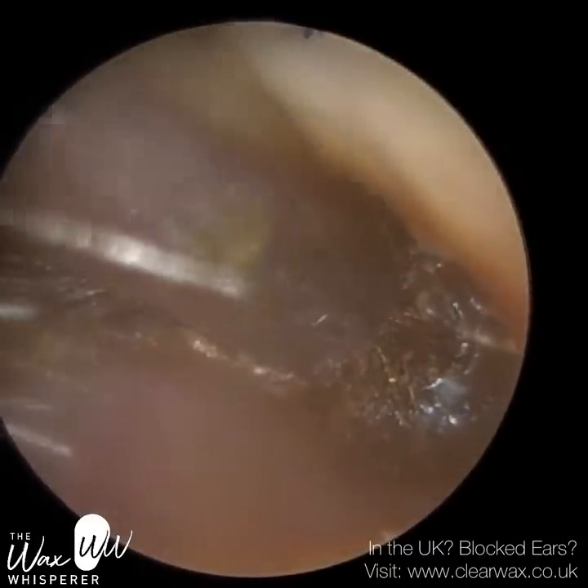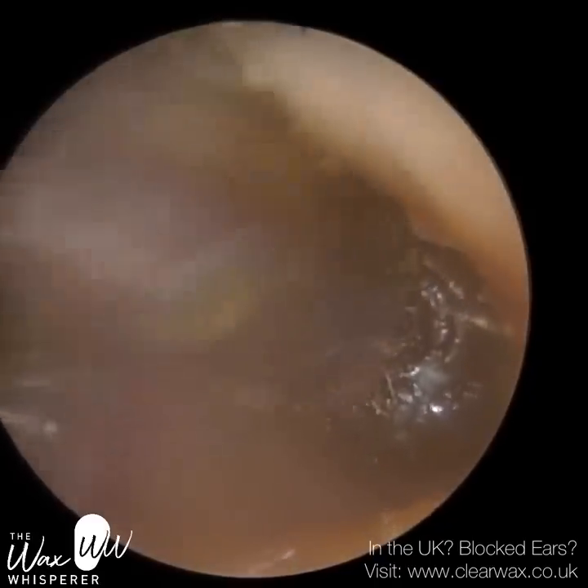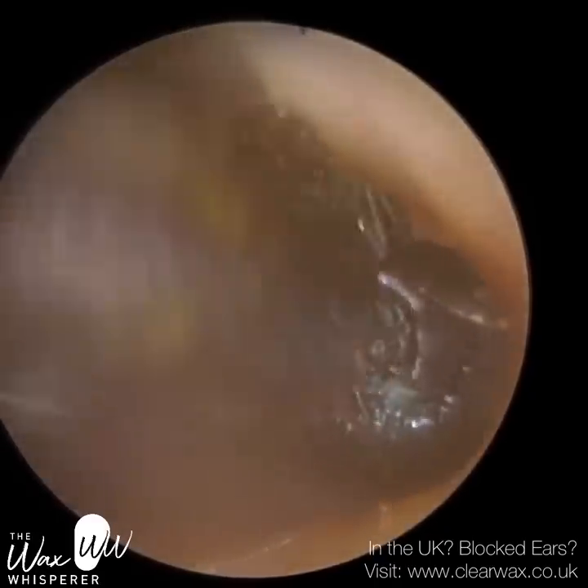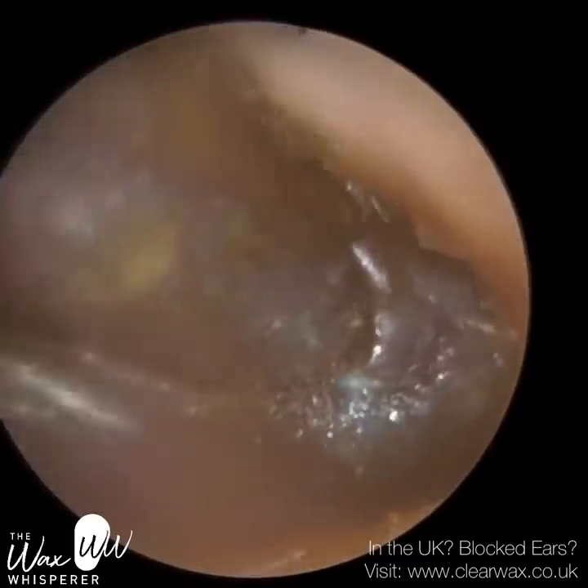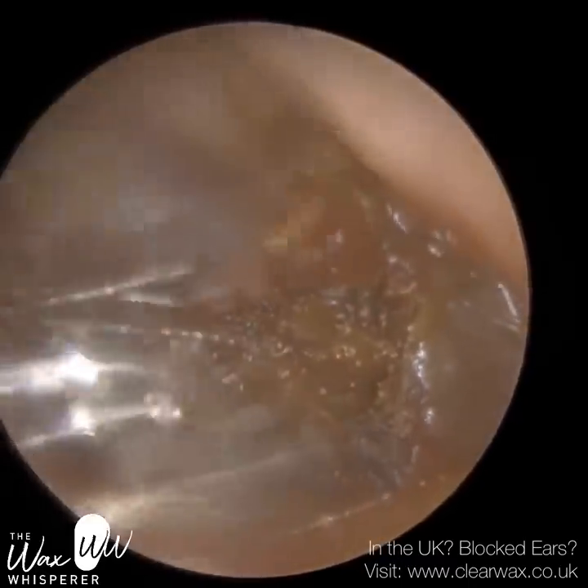But when we're working as deep as we are, we just have to be cautious. Sometimes you can get osteomas — bony growths — hiding behind this wax, which we're unaware of. So it's always possible we could make contact with those.